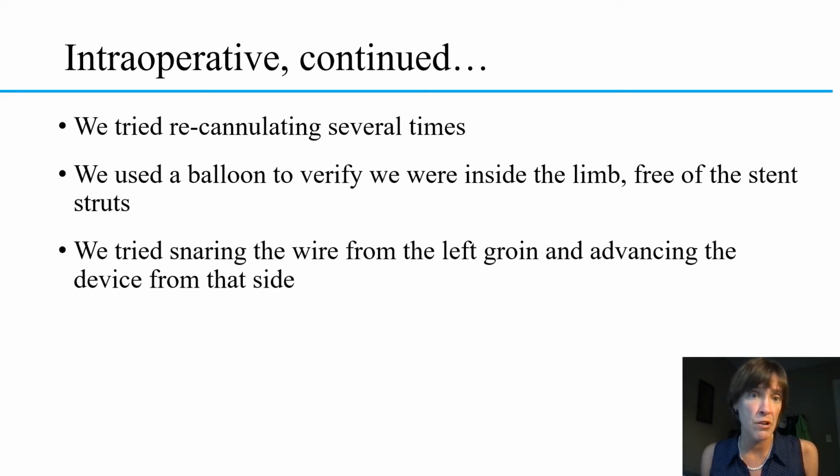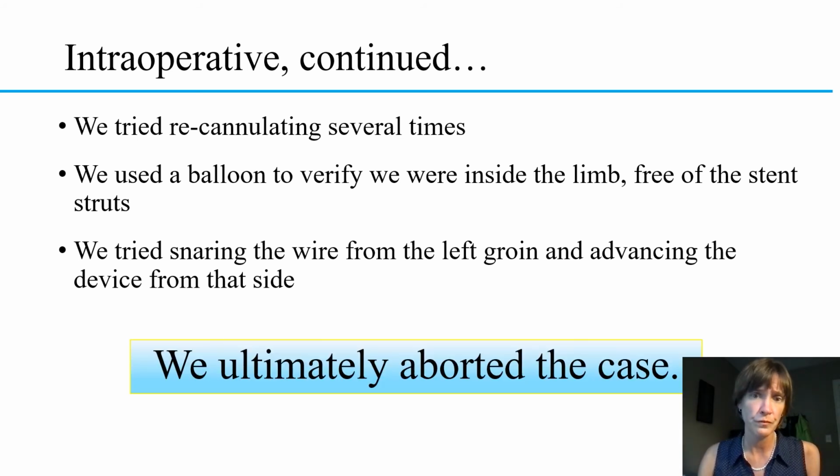We tried snaring the wire from the left, as I said, and advancing the device from that side, but again, we had similar problems no matter where we tried from. So we ultimately aborted this case.